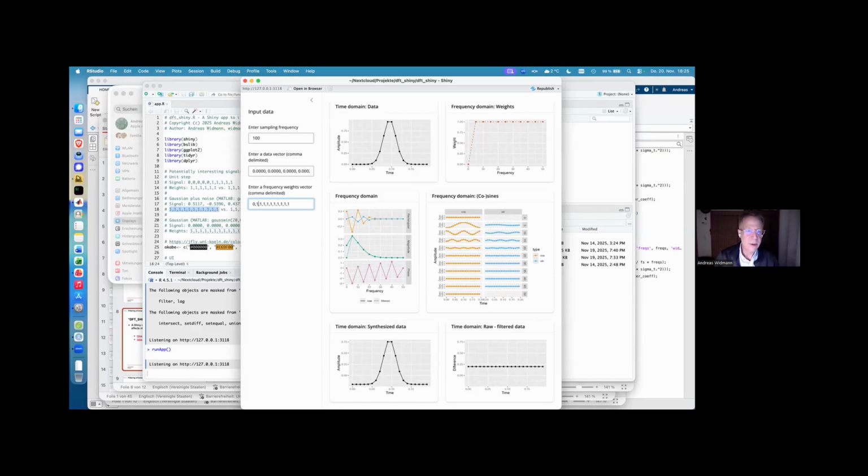But already the next lowest frequency component, the 5 Hertz component here, removing that has really dramatic effects on the signal. That's why in ERP, EEG and MEG, high-pass filters are much more problematic than low-pass filters, because you have these kind of monopolar signals which are not oscillating. If you remove these low-frequency components, this typically has dramatic effects. You might have seen that if you filter EEG or MEG blinks with a high-pass filter, these blinks look like a Mexican hat. This is the prototypical high-pass distortion you see.